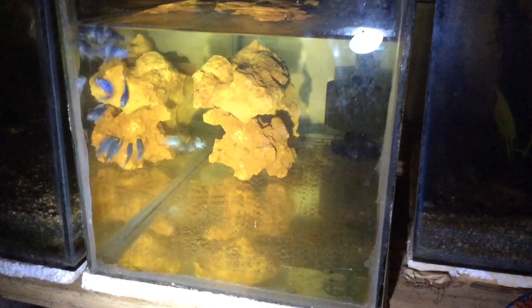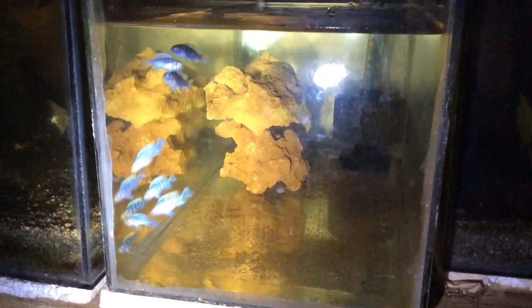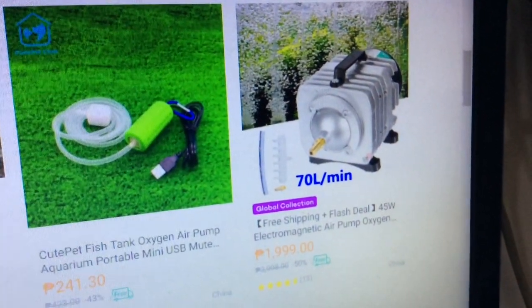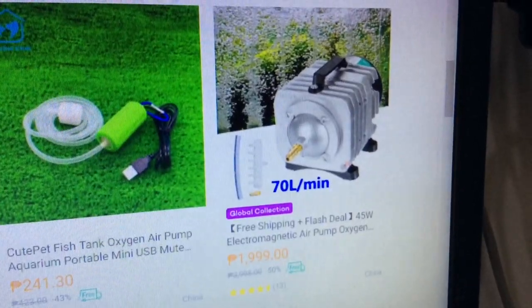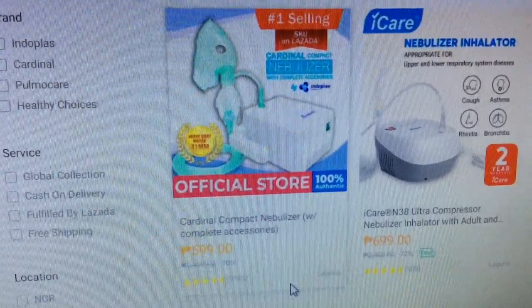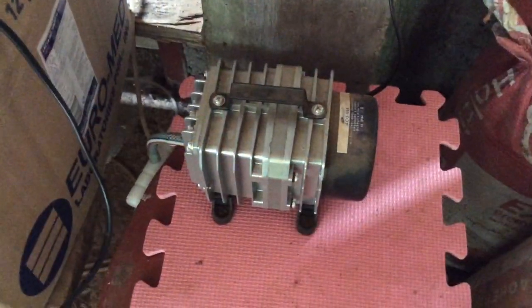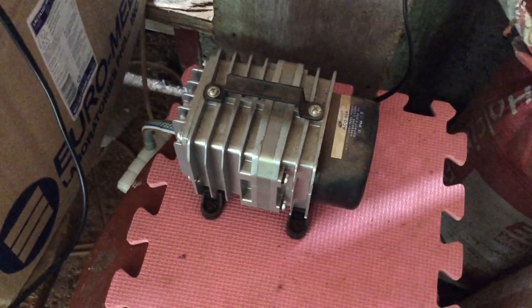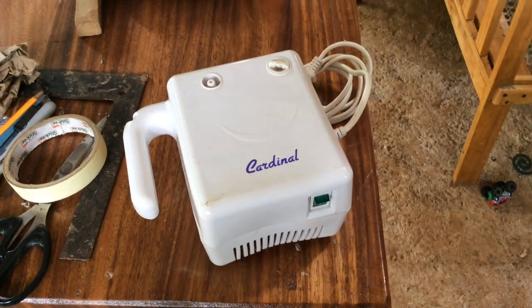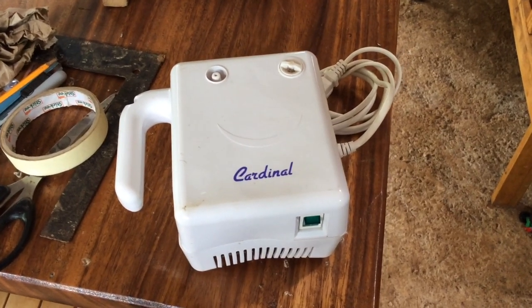This aerator is a 40-watt rating aerator and it only costs 700 pesos. To give you an idea about the price, this other aerator costs almost 2,000 pesos, and this nebulizer kit only costs 600 pesos. The aerator I am using is a Resan aerator, 40-watt rating, model ACO 004, 220 volts.